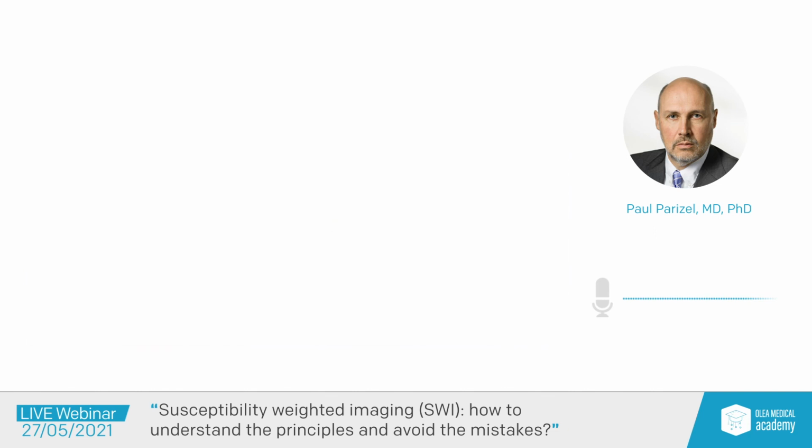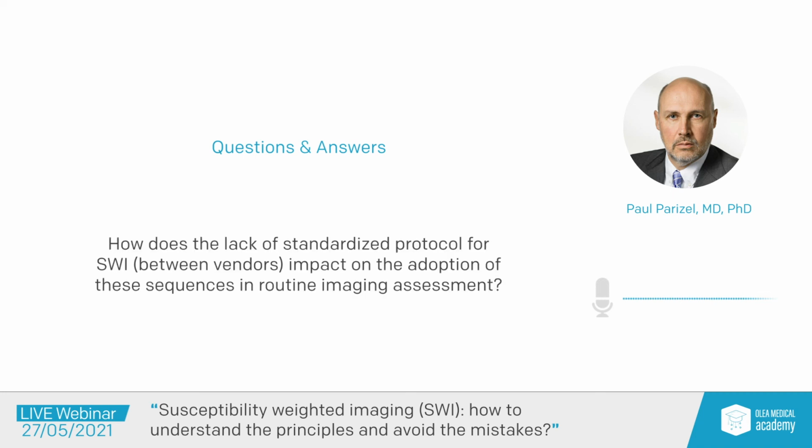Thank you very much, Professor Parizel. I will be asking some of the questions that I have received from the audience. The first one is, how does the lack of standardized protocols for susceptibility weighted imaging between vendors impact the adoption of these sequences on routine imaging assessment?